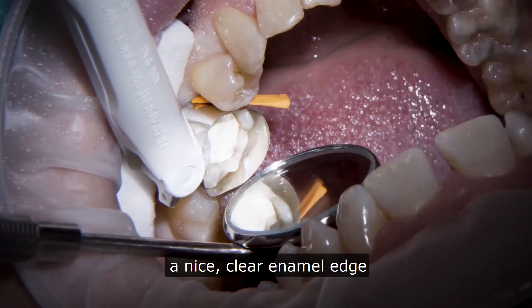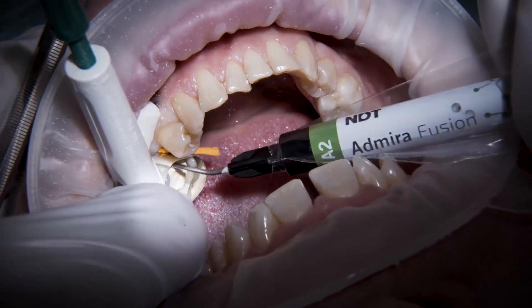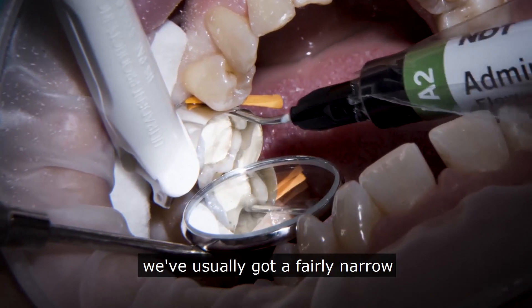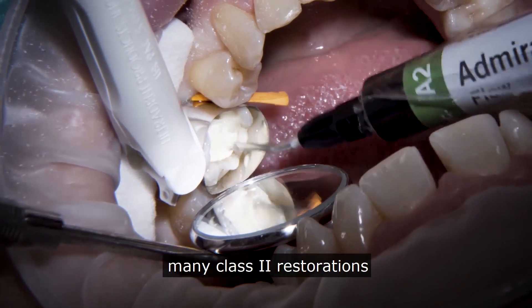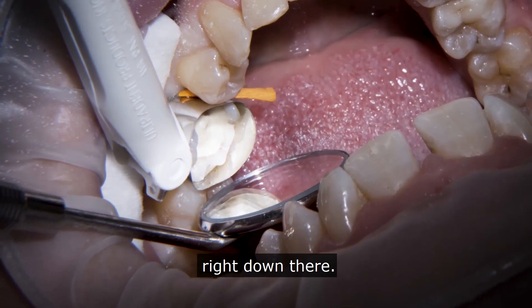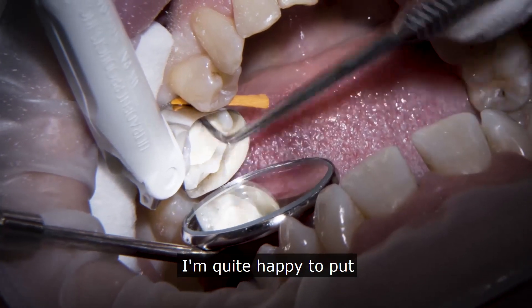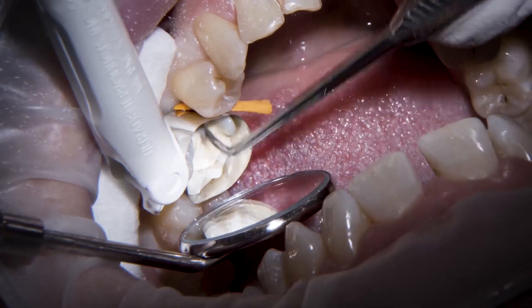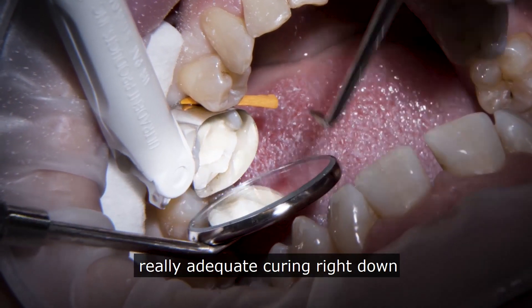At this point I just want to have a look down there, make sure we've got a nice clear enamel edge, nicely bonded and clear. The difference with having biodentine in here is that we usually end up with a fairly narrow, shallow box in the class two restoration rather than it being quite open, so we really want to make sure the curing goes right down there. Because we've got that nice deep base, I'm quite happy to put quite a bulk of composite — or Ormocer, I should say — in.